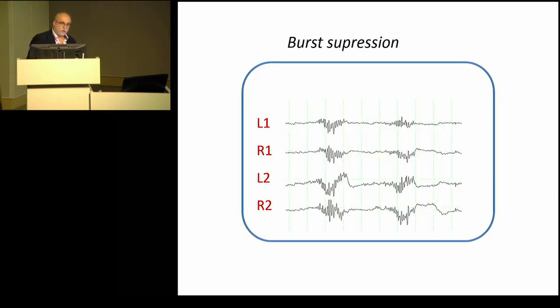If the anesthesia goes deeper, you can also see this in the monitor. You all know what it is: the well-known burst suppression waves. Now you can see the part of flat EEG activity, the suppressed activity, together with the burst activity. Suppressed, burst. The deeper the anesthesia is, the longer the suppressed part of the EEG lasts.